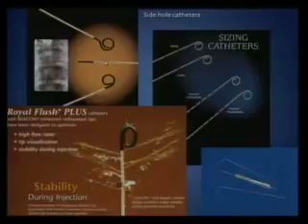Side hole catheters are here. See, these are the side holes. This is a sizing catheter. Sizing catheter means you need to know the size. Every 1 centimeter there's a mark. So when I do a TIPS, I actually put the sizing catheter to know the size of the stent. When you do peripheral angioplasty, you need to know the size of the stent you need to put in.